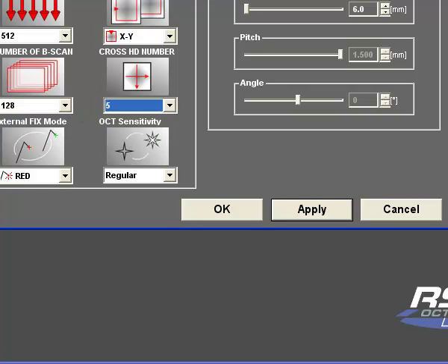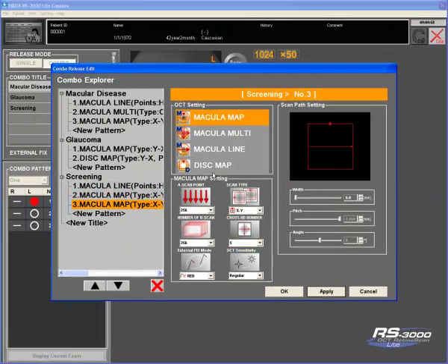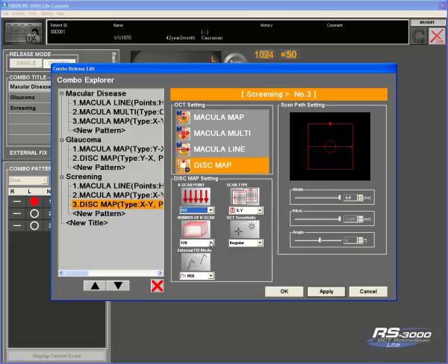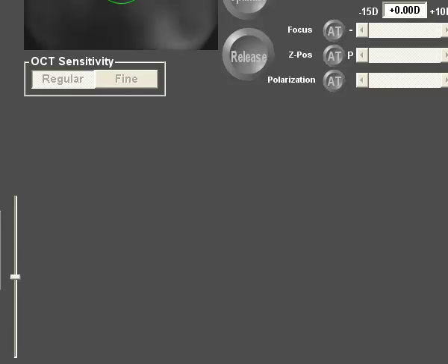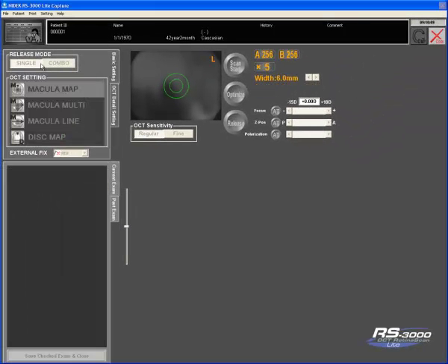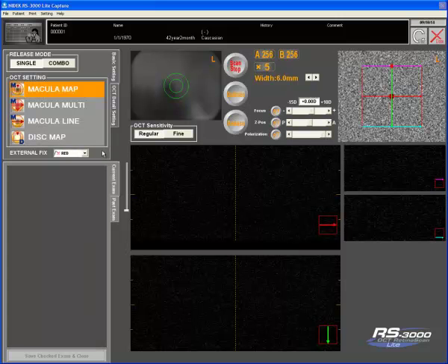And finally for screening, because I want to examine both the macula and the disc, I will do a disc map, again setting the settings I want. Hit apply and OK and you will see over here now that I have saved those settings. The machine will then start again.